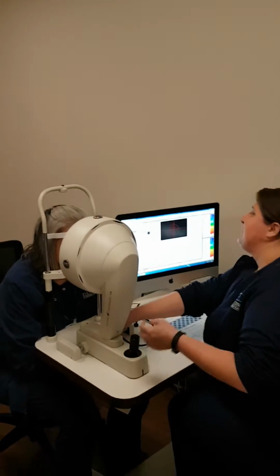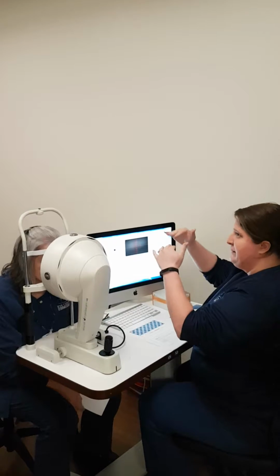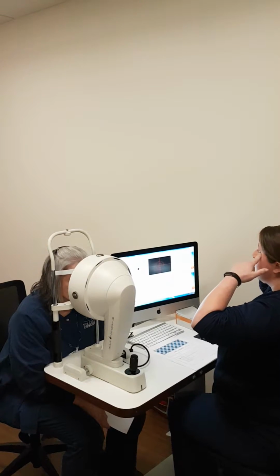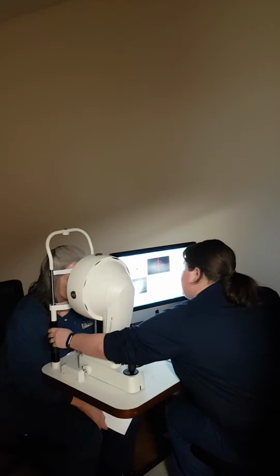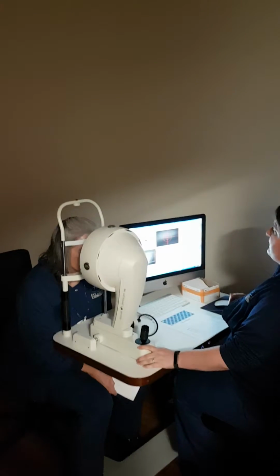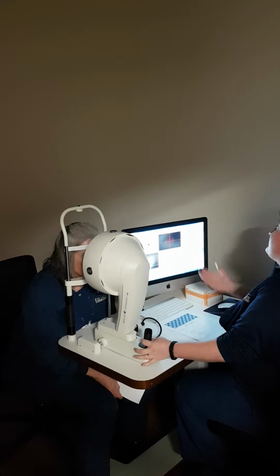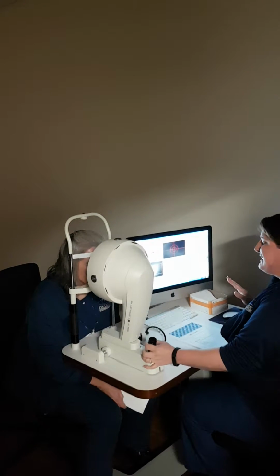As with every machine that we use, there's the alignment issue. The patient has to be straight ahead. You want the chin rest to have their canthus right next to that little black line. That's fine. You can adjust the chin as needed to make sure the patient's in the right place. I start with the machine completely back towards me with the joystick as far back as I can possibly get. This works kind of just like the slit lamp.